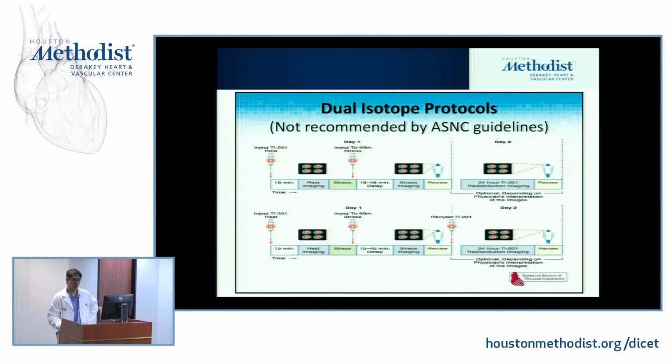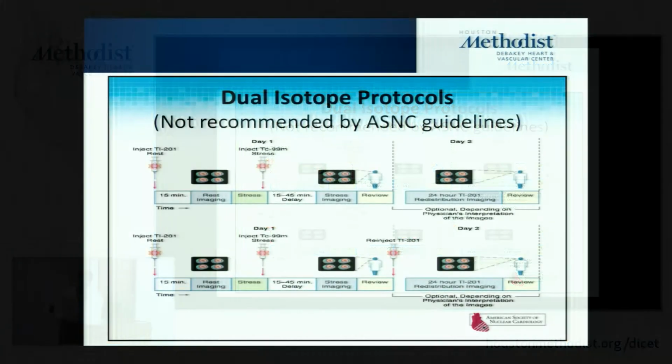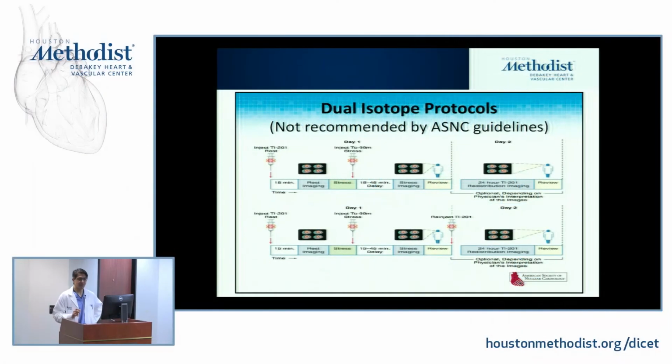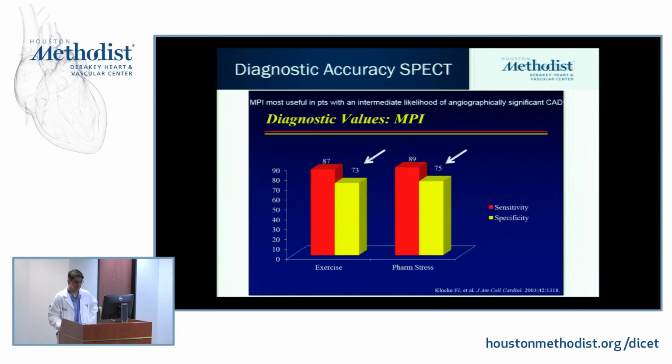So a quick word on dual isotope protocols. You will rarely see us doing technetium and thallium on the same patient. We only do this in viability cases, and the reason why it's not recommended as your go-to default for routine stress imaging is, again, exceptionally high radiation doses.